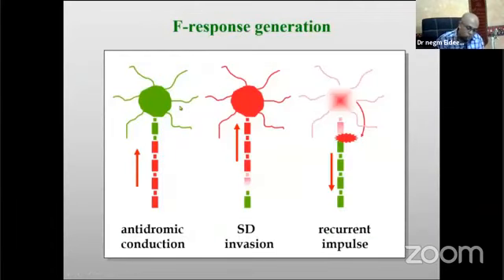The physiology behind this is that the axon is activated in antidromic direction after distal stimulation, and it invades the motor neuron that then becomes depolarized, and it stays depolarized for a short while when the axon now is starting to become repolarized and ready for a new impulse.